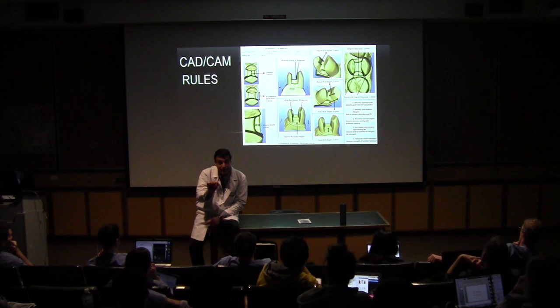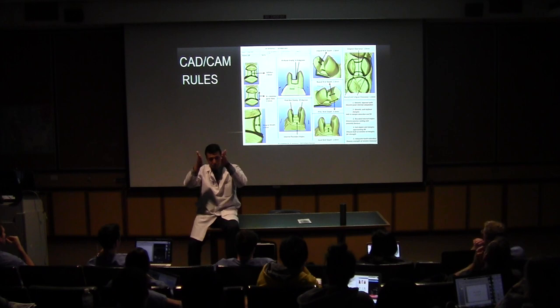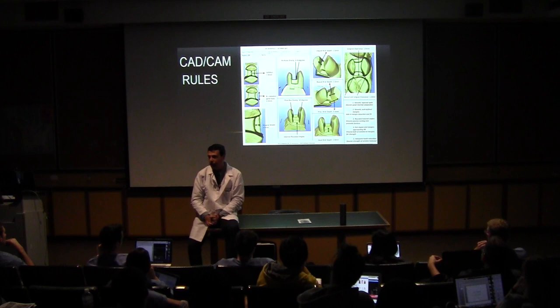What if you take impressions and send this case to a lab? Why do you need clearance? As Dr. Porter mentioned, the technician needs to use a saw and cut that particular tooth in order to also adjust the proximal contact later on. See how simple it is?